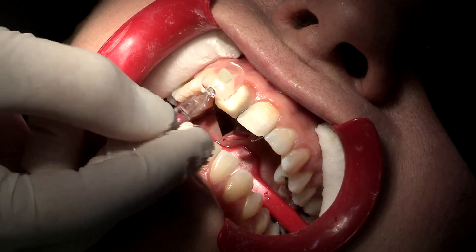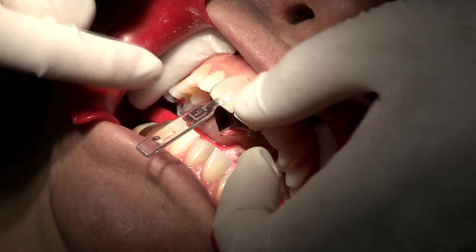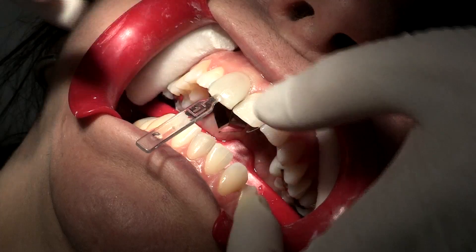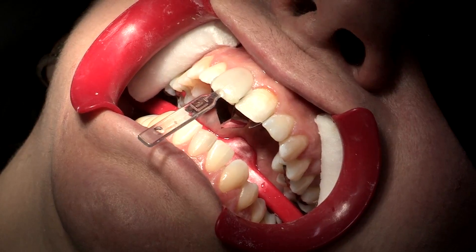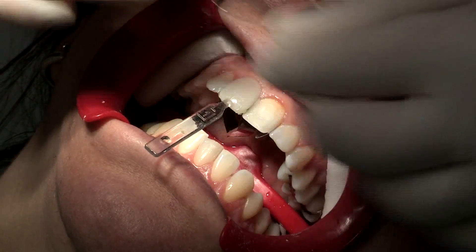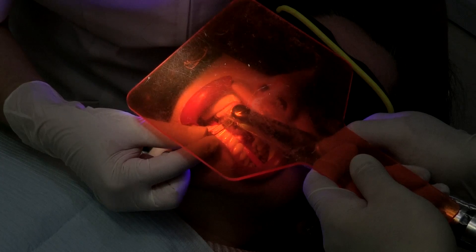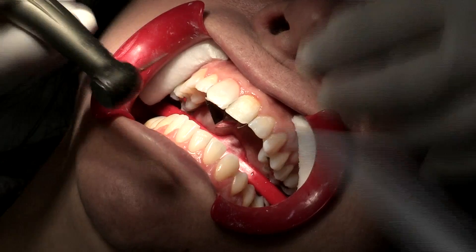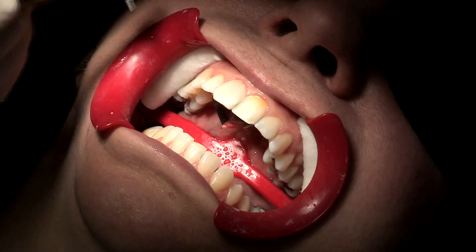Very little bit. Then I combine it with the uncured composite on the tooth and I press. There is a midline line that I need to be in the middle of the tooth, parallel to the long axis of the face and perpendicular to the incisal line. I inject a little bit more flow here to fill up the tray, then clean around it with a probe. Press a little bit more and then we cure for 30 seconds. Then we remove the template — see how easy it comes out. Now we go around it and clean the excess. We do not touch the buccal surface because it's very shiny.